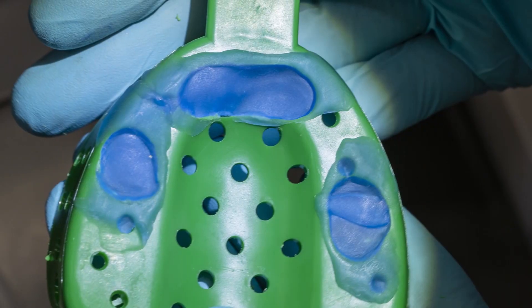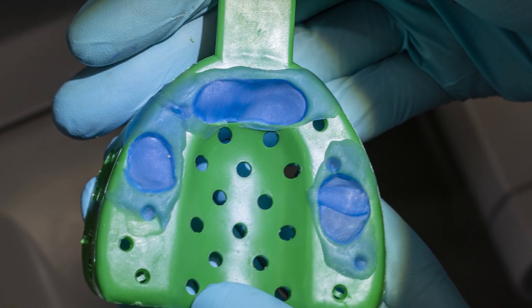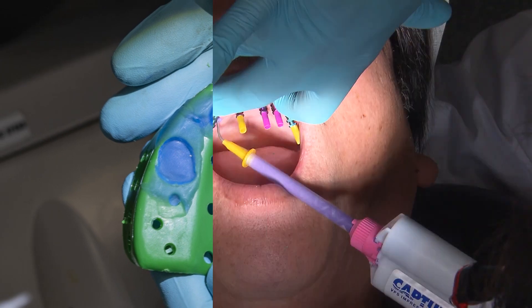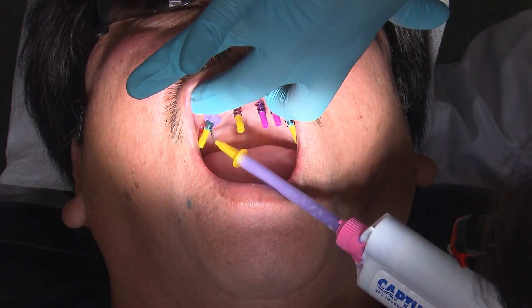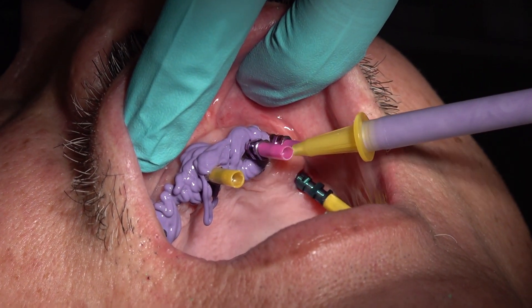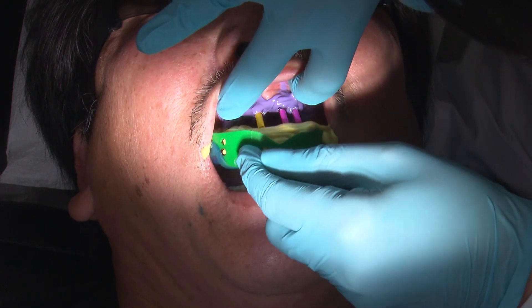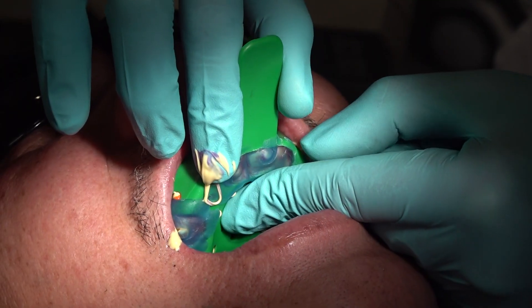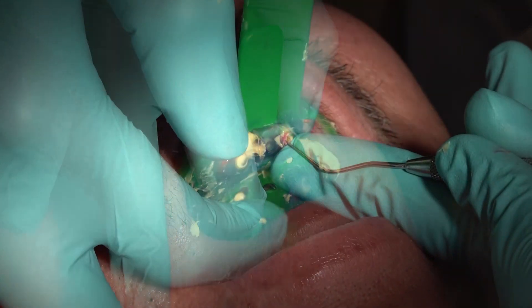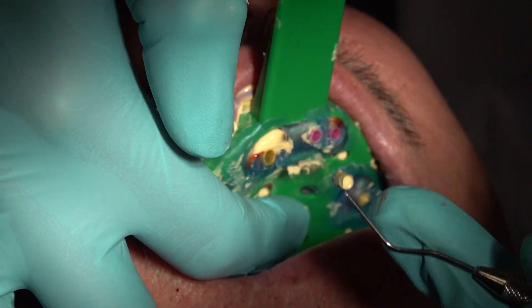Once I verify that there is enough room around each coping, I like to place a soft wax on top of the holes I just created. Here I am using blue periphery wax. This will keep my impression material in the tray, making locating the guide pins during the impression much easier. At this point, we are ready to take our impression. Just like taking an impression on natural teeth, we want to capture as much information as we can. I like to syringe a light body PVS material around the transfer copings while my assistant loads the tray with a heavy body PVS. Be sure to fully seat the tray so the guide pins poke through the wax. Before the PVS fully sets, be sure you can identify the top of each transfer coping. Once the impression material fully sets, you can easily remove any impression material in the plastic sleeve, allowing for easy access to the top of the guide pin.